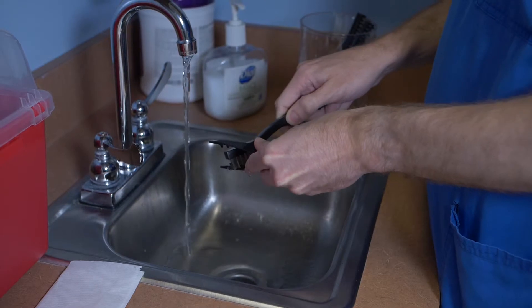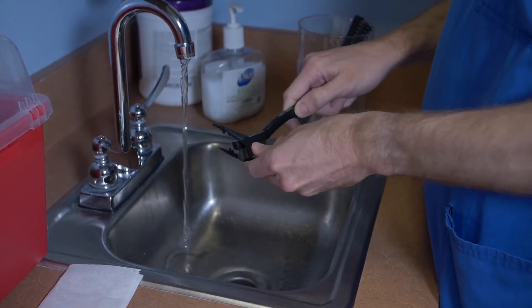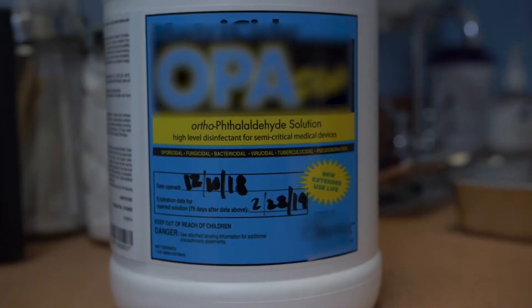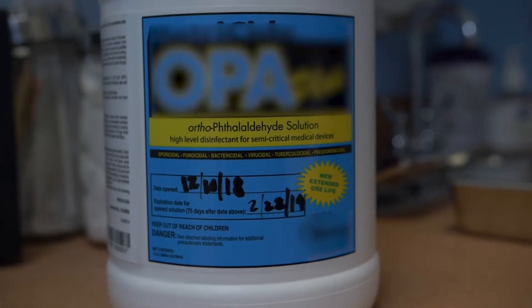Sanitize the items that require chemical sterilization by scrubbing off all debris. Rinse and dry, paying attention to detail. Read the manufacturer's instructions on the original container of the chemical sterilization solution.